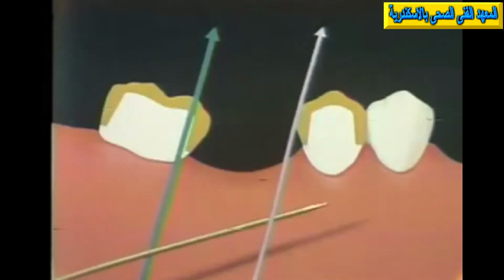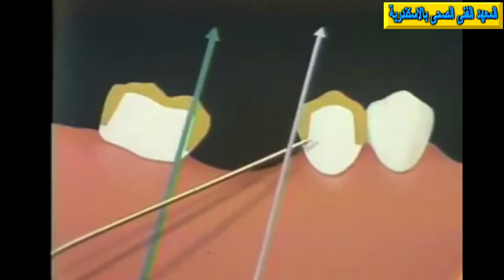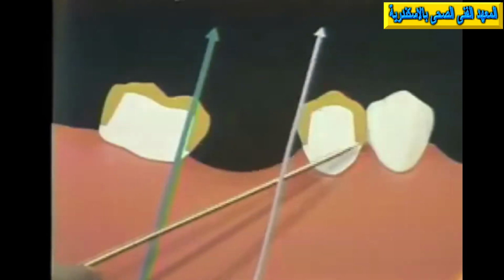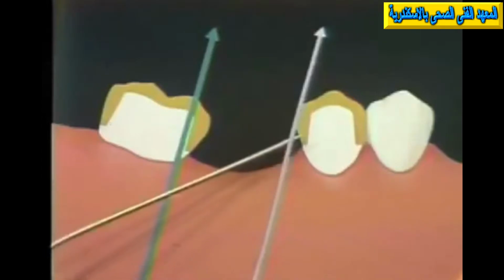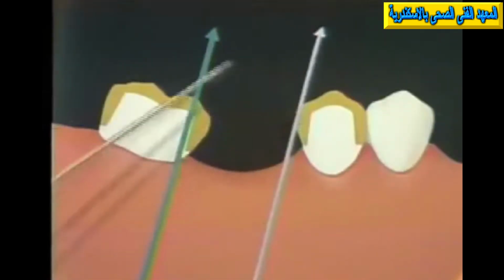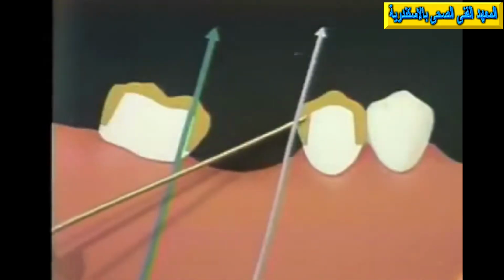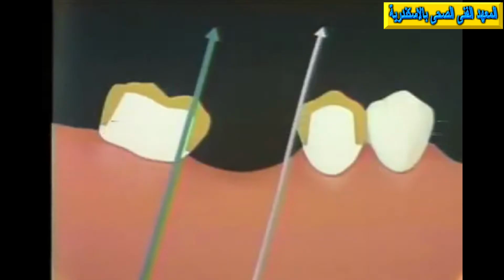So that then we have a bridge in two sections in which this can be cemented in on its own line of insertion and clear this problem situation here. And then after that is cemented, the rest of the bridge with the pontic and the semi-rigid connector can be inserted on the common line of draw between the semi-rigid connector and the molar preparation here.